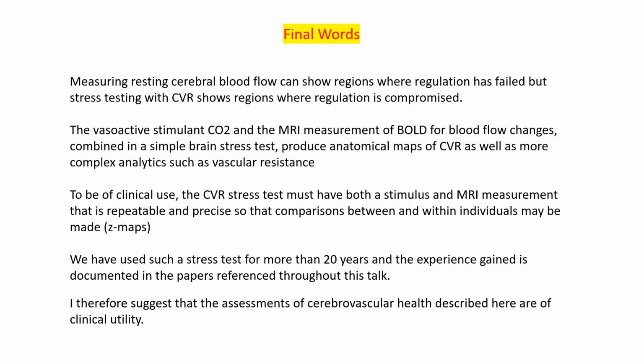The vasoactive stimulus carbon dioxide and the MRI measurement of BOLD for blood flow changes, combined in a simple brain stress test, produce anatomical maps of cerebrovascular reactivity, as well as more complex analytics such as vascular resistance. To be of clinical use, the stress test must have both a stimulus and MRI measurement that is repeatable and precise, so that comparisons between and within individuals may be made, the Z-maps.